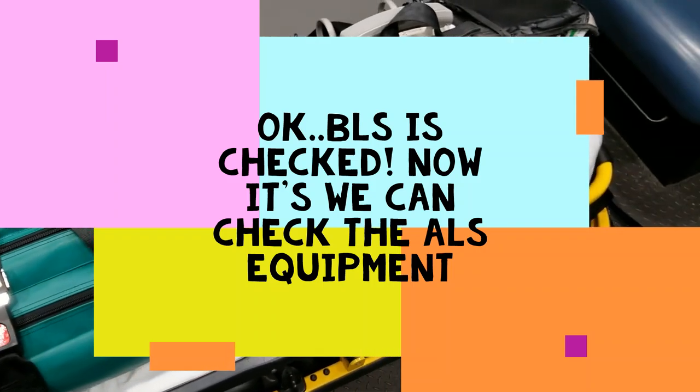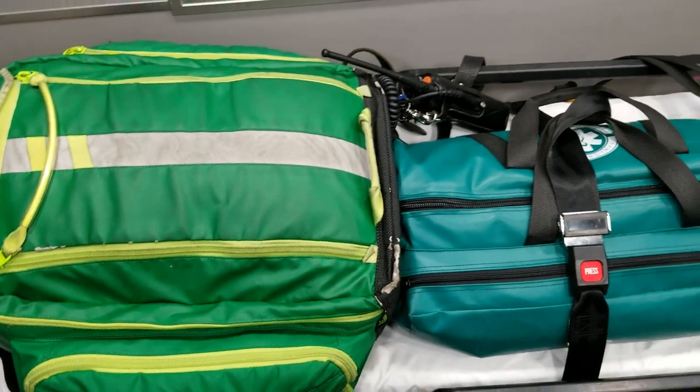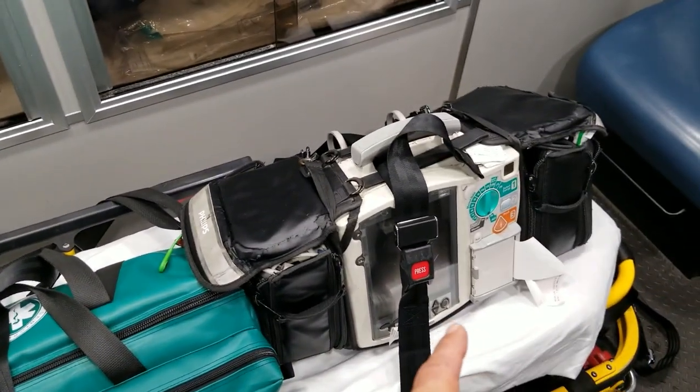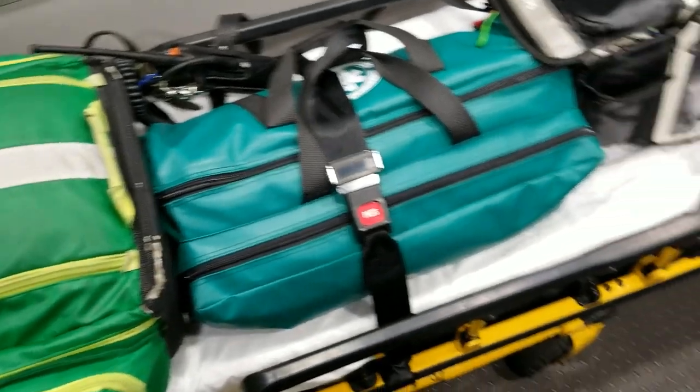I don't wear the vest to every single call but I do carry it on the ambulance every shift. Depending on the potential level of danger, that will determine whether I'm wearing it on a specific assignment. As ALS providers in both the 911 system and inter-facility transport system, we're supposed to carry three bags: the ALS response bag, an oxygen bag, and the cardiac monitor, along with transport equipment.